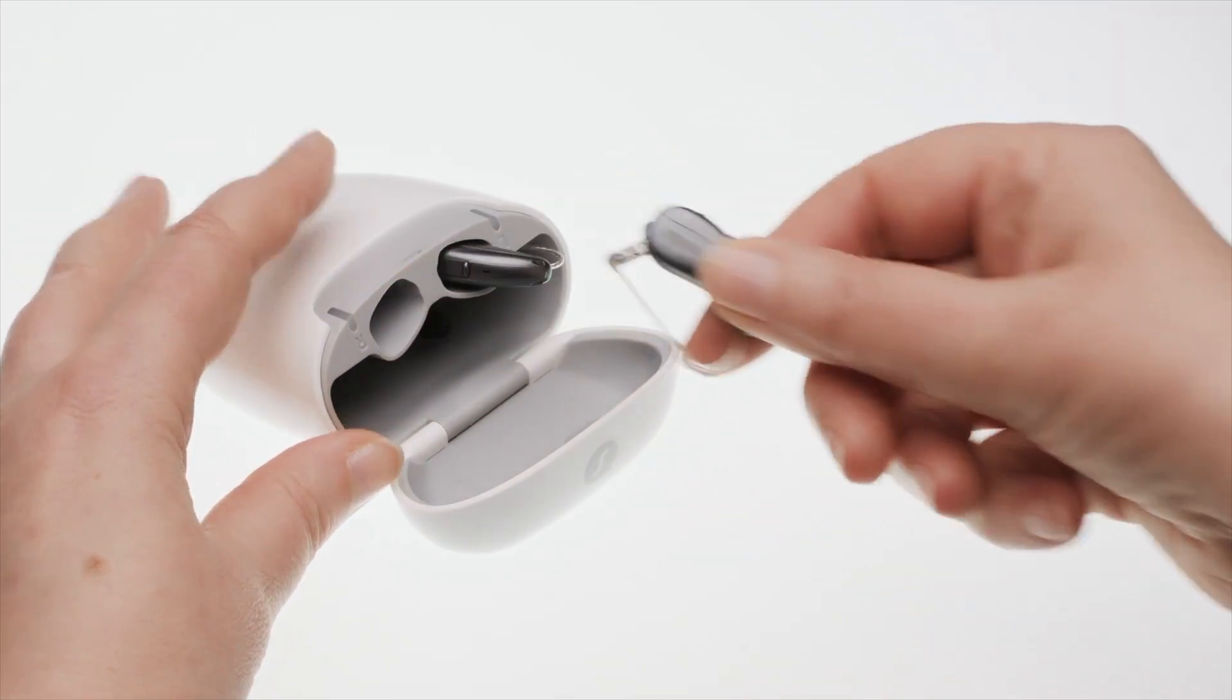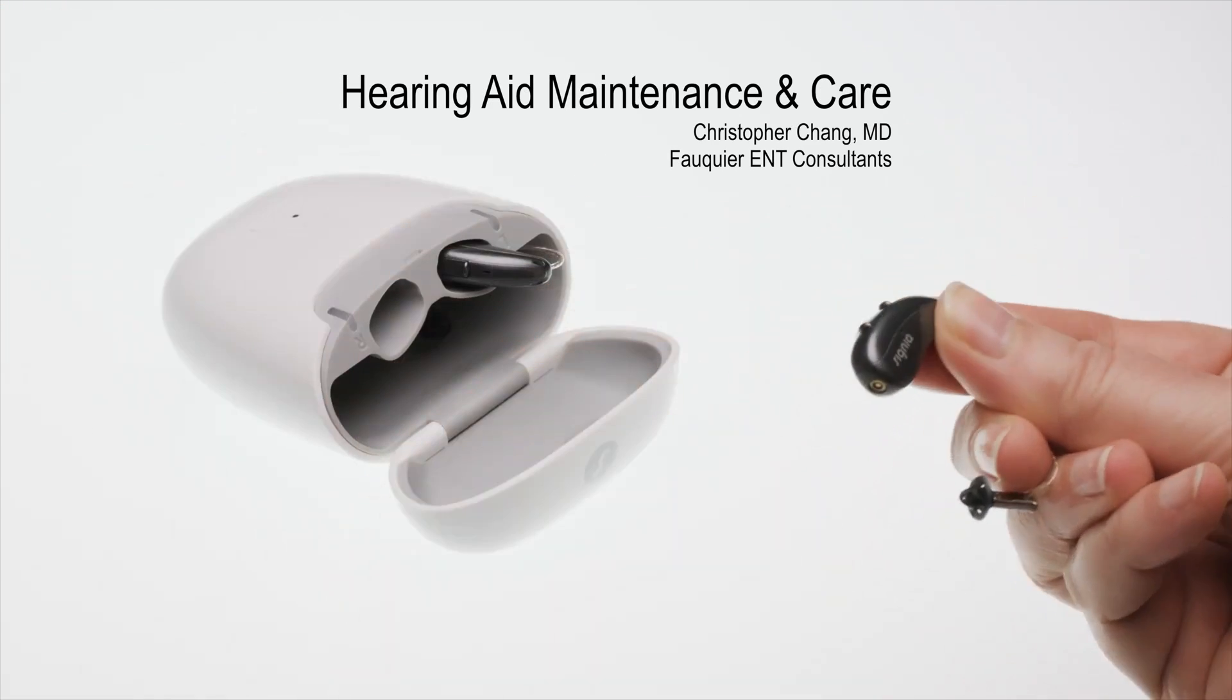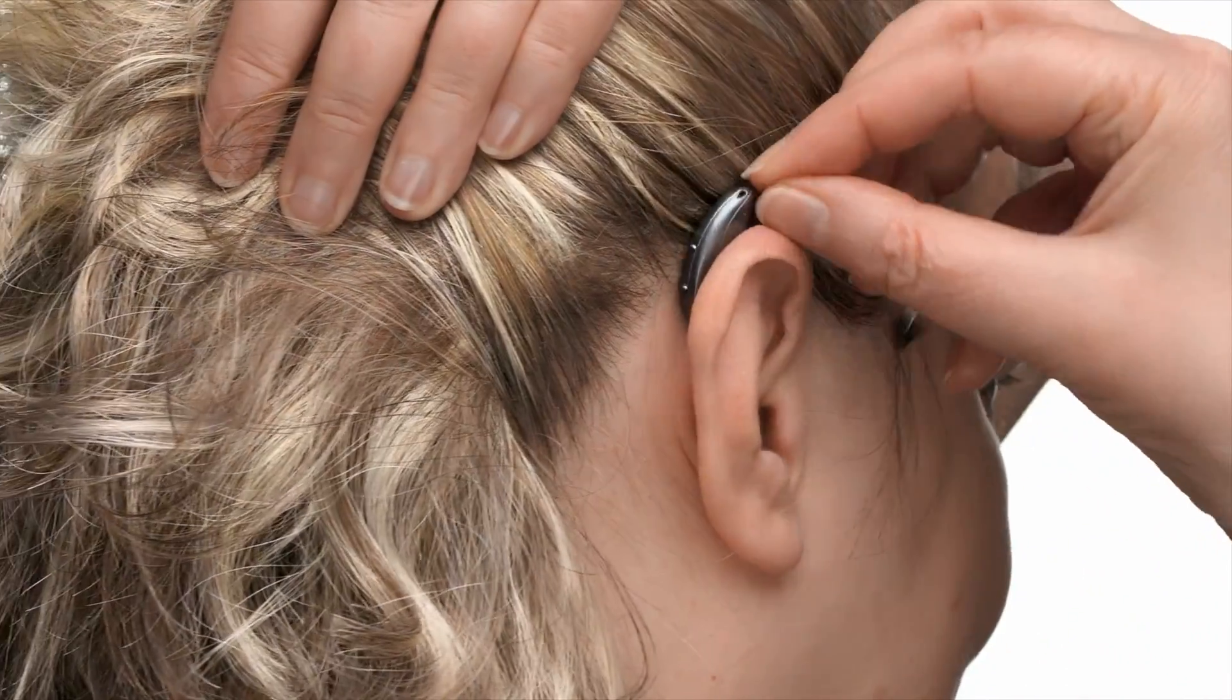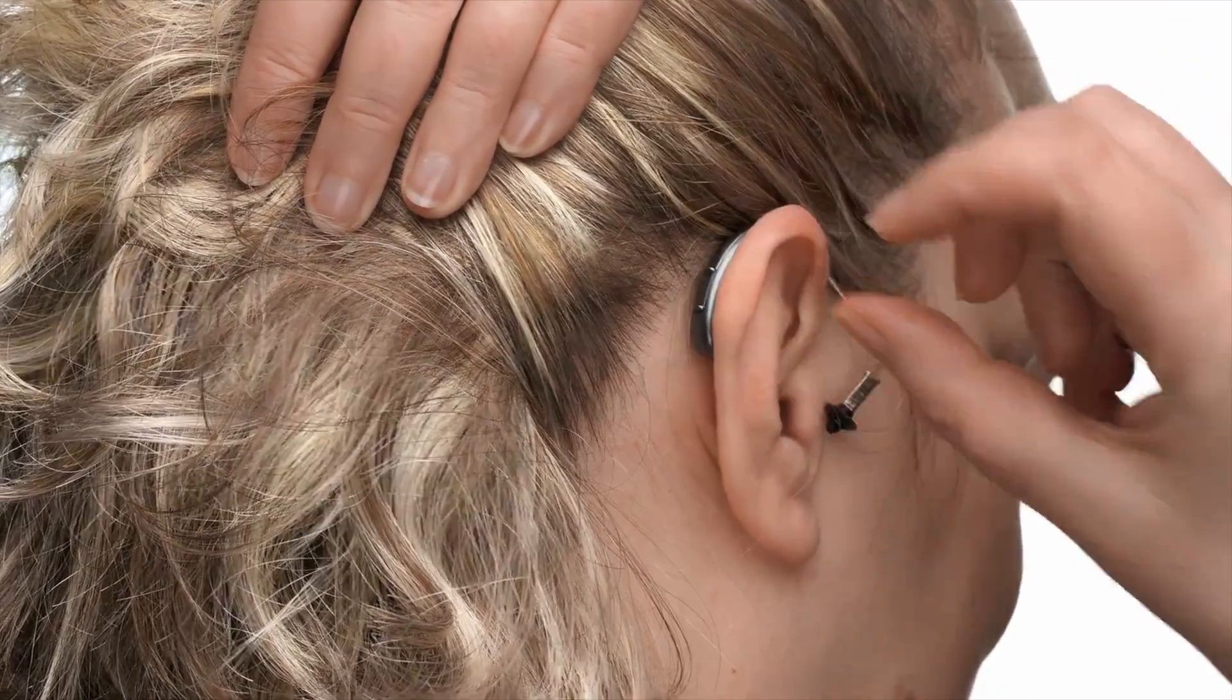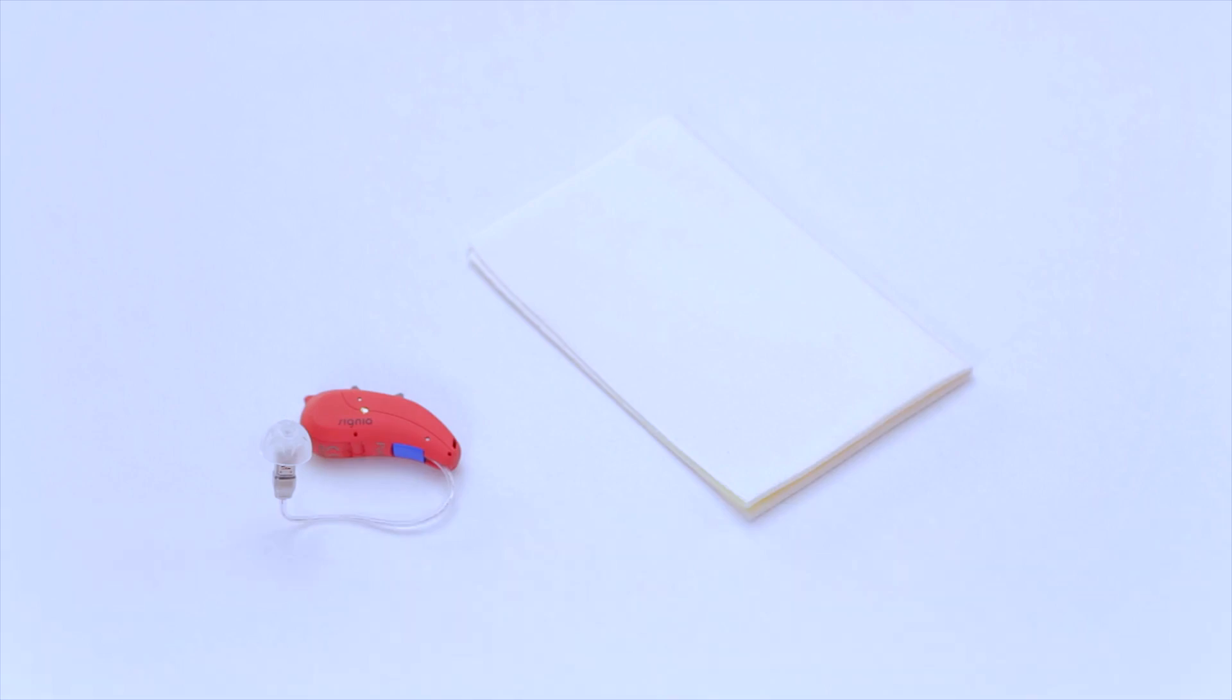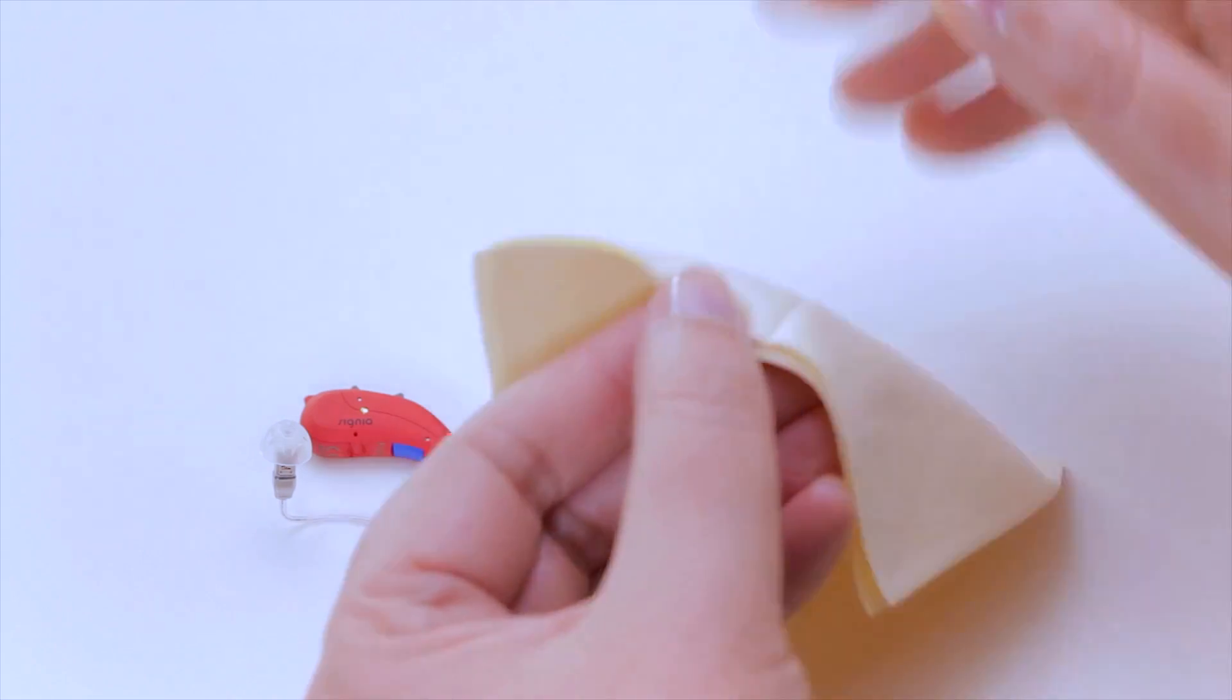In order for a hearing aid to function at its best with minimal degradation of sound quality, regular cleaning and maintenance of the hearing aid should be performed. This video will demonstrate not only how to clean the hearing aid, but also troubleshoot the most common reasons a hearing aid's performance degrades.